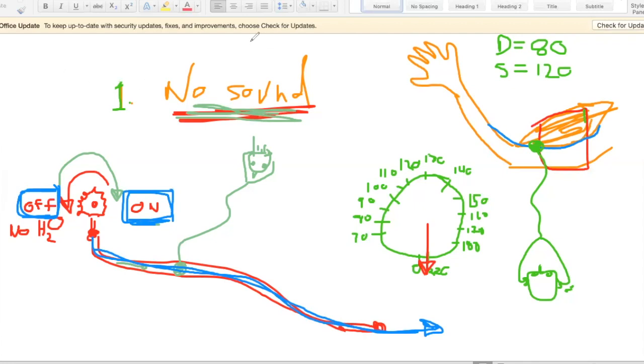And when you're listening to blood pressure, you're actually not listening to the heart sound at all. You're not listening to the heartbeat, even though when you listen through the stethoscope, it's going to go boof, boof, boof, boof, boof, boof, and that beat is going to be very correlated with the heartbeat. But you're actually not listening to the heart itself. Now, if you put this stethoscope in front of somebody's heart, like your doctor does, then you will hear the heartbeat. But when you're taking blood pressure, you're not listening to the heartbeat.